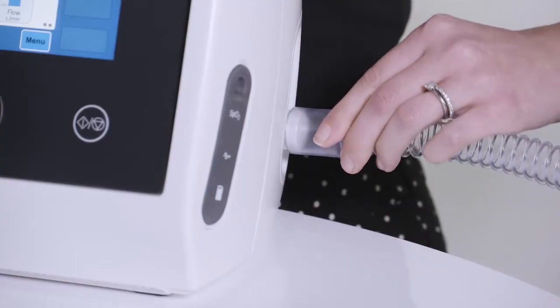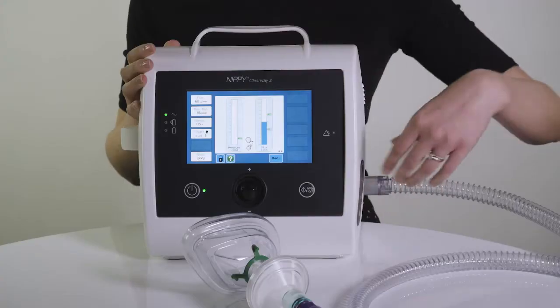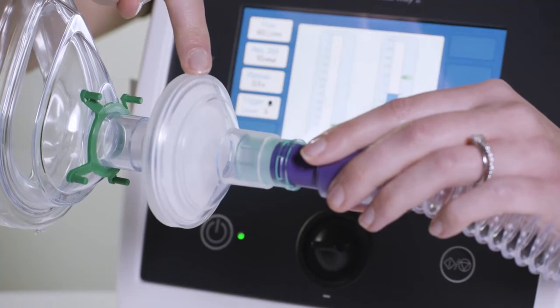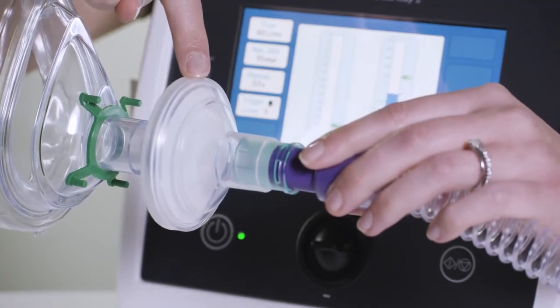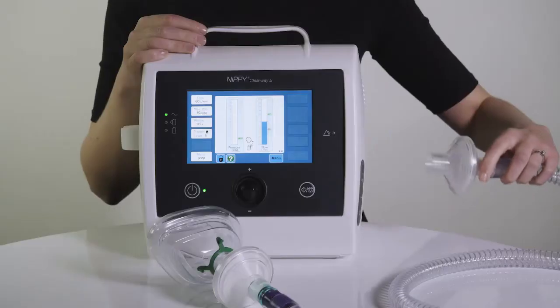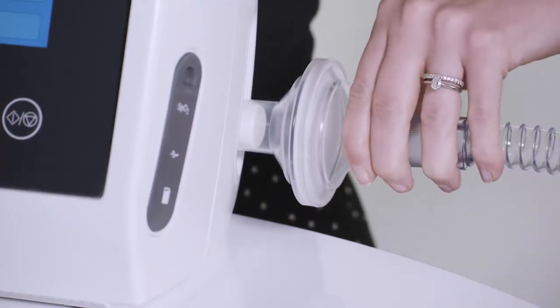Connect the Clearway 2 circuit to the air outlet on the side of the device. Breas recommend that a bacterial filter is always used with the Clearway 2, and this should be at the patient end of the breathing circuit, but it can also be connected directly to the Clearway 2 for convenience.